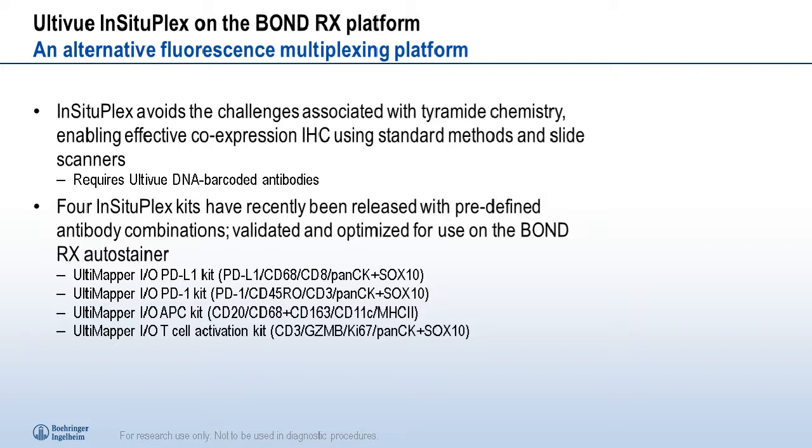And so over the next set of slides, I'm going to walk you through some of our experiences with alpha and beta testing each of these kits, and some of the experience that we have and some of the insight that we have from this experience.